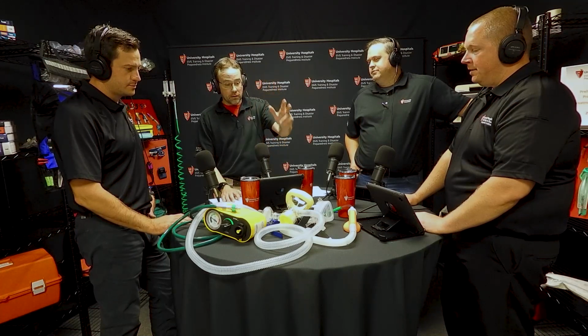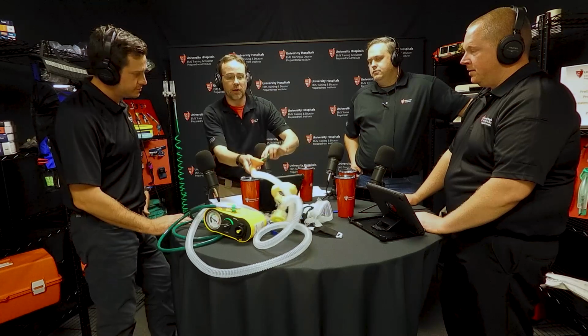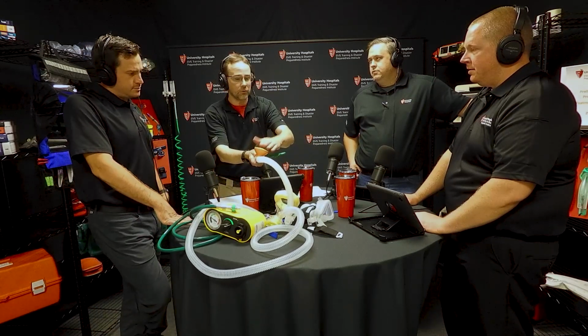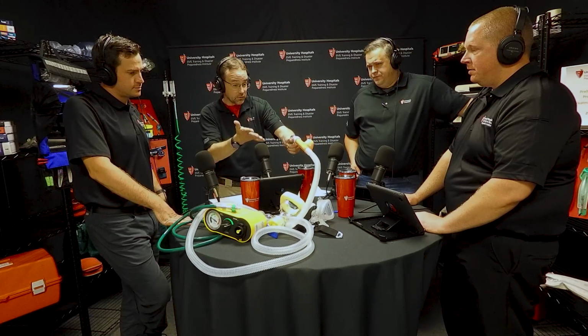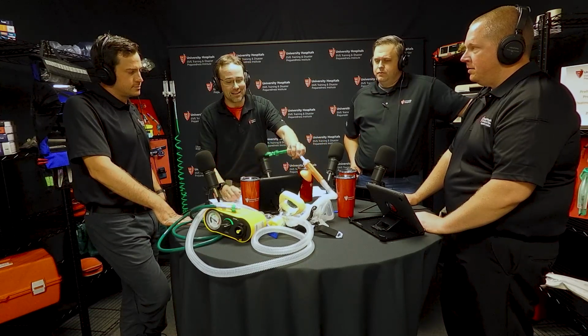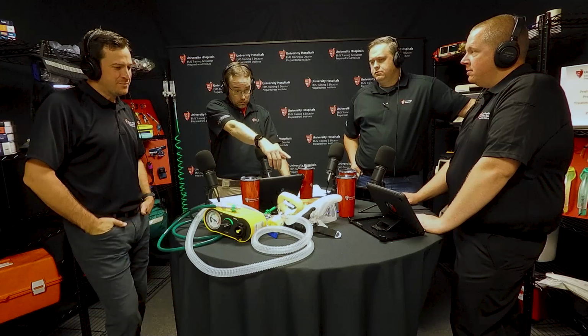and these Venturi devices that plug in entrain room air. So in its supplied configuration, this cannot give us 100% FiO2, and that's where this thing shines, right? Of all of my praise, the mask causes me trouble, right? But this is easily correctable, right?